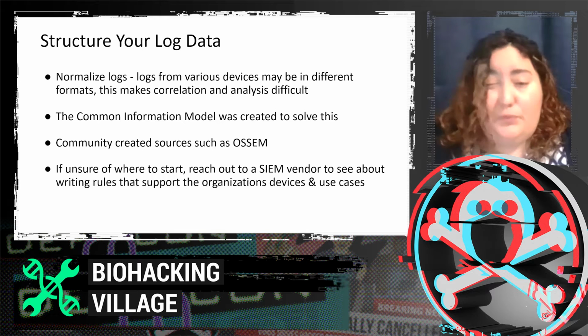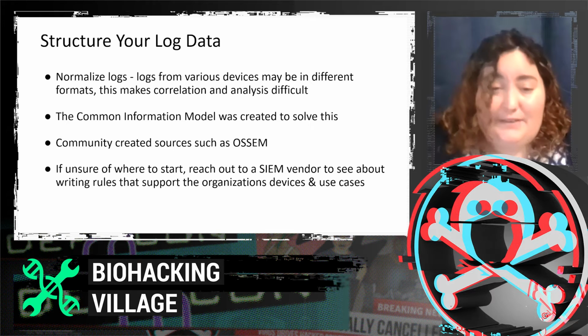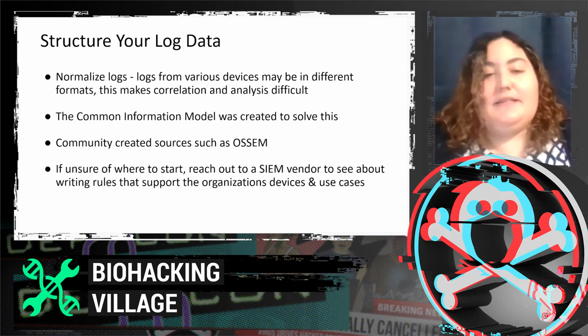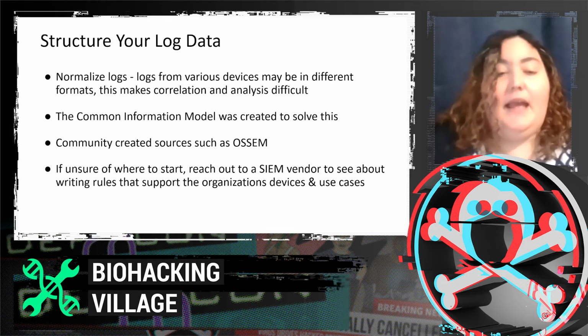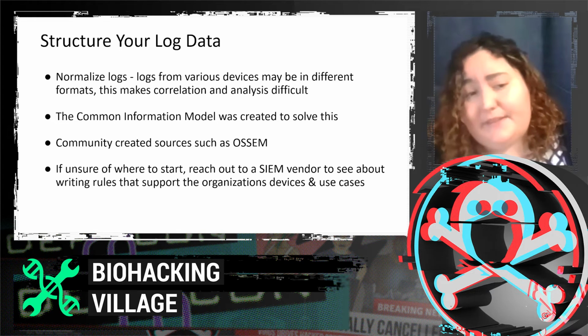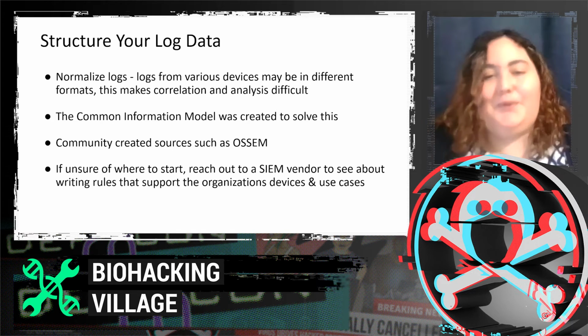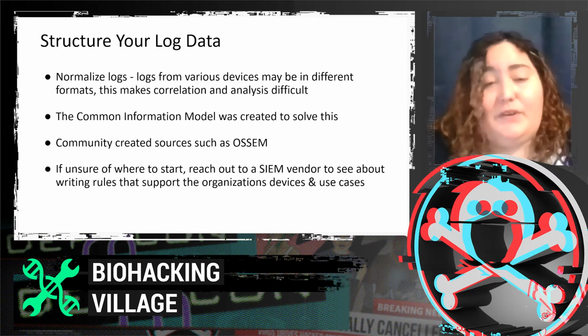If you're unsure of where to start, or you want some structured guidance, there are many different SIEM vendors, and so you can reach out to them and see about writing rules that support your organization's devices and use cases. Don't feel pressured by these salespeople. Make sure you're in control of your conversation.